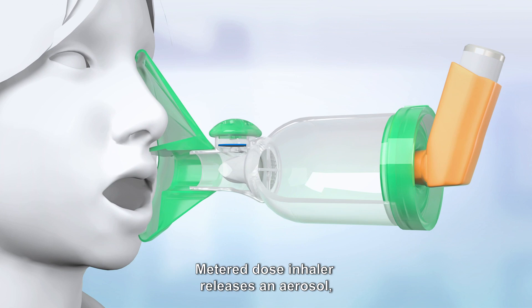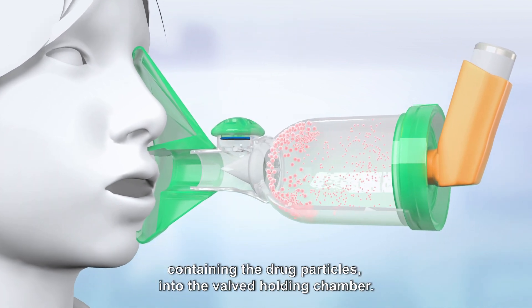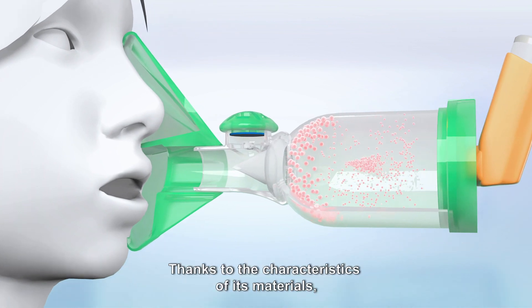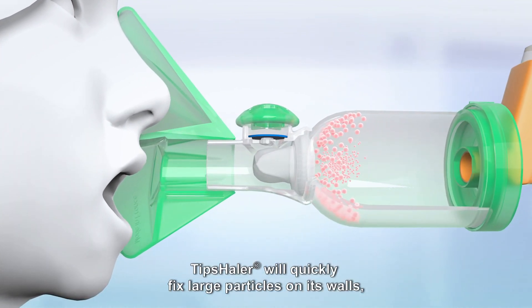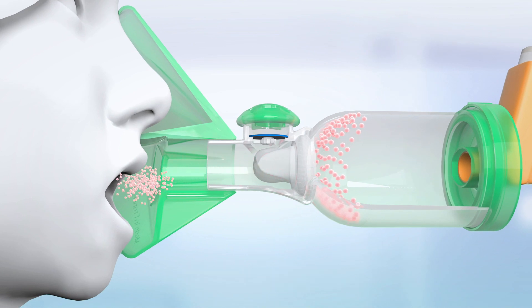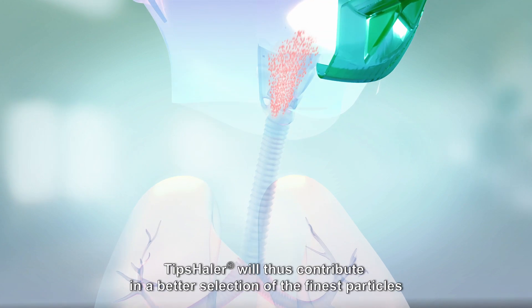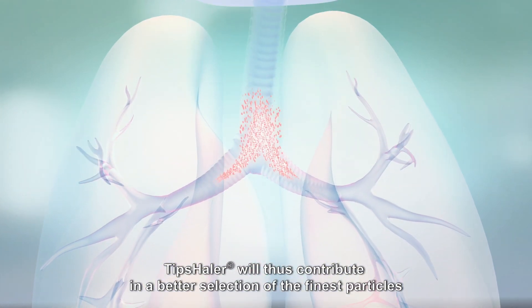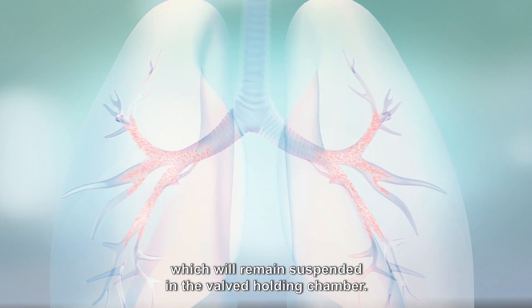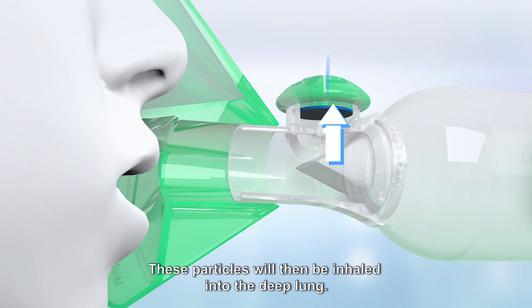The metered dose inhaler releases an aerosol containing the drug particles into the valve holding chamber. Thanks to the characteristics of its materials, TipsHaler will quickly fix large particles on its walls, preventing their impaction in the throat and the trachea. TipsHaler will thus contribute to a better selection of the finest particles, which will remain suspended in the valve holding chamber. These particles will then be inhaled into the deep lung.